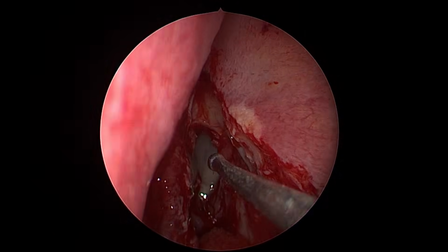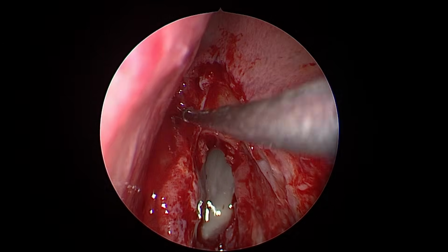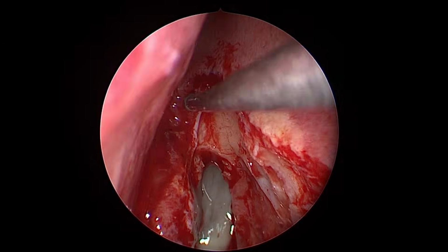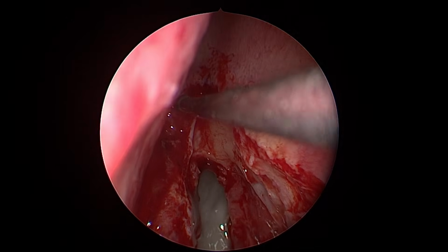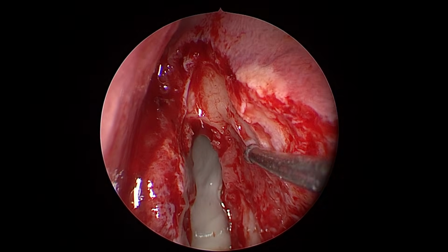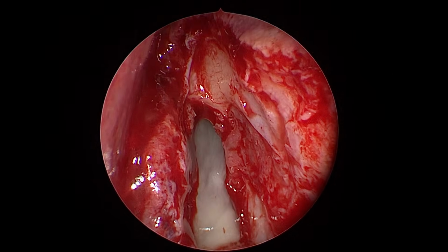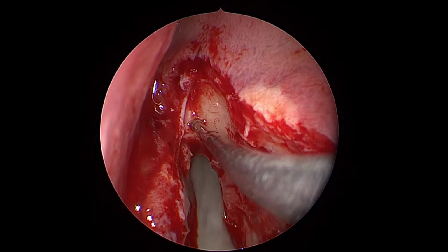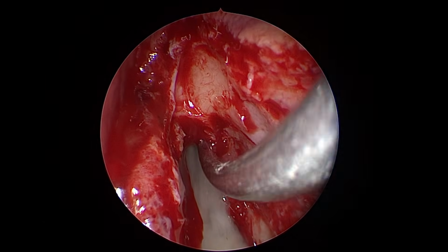Coming back to the landmarks: follow the middle turbinate, there is the axilla. Can anybody see the axilla easily? Yes. Open up the axilla completely. Once you open it, you see the beak. Once you see the beak, follow the beak, and you are in the frontal.